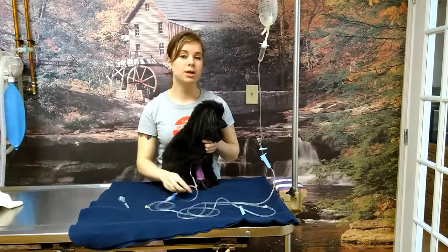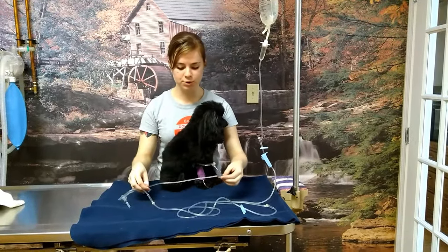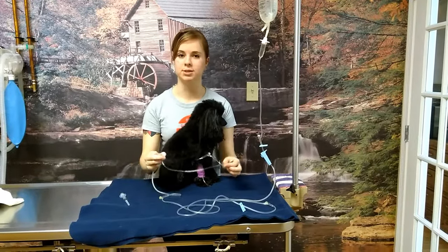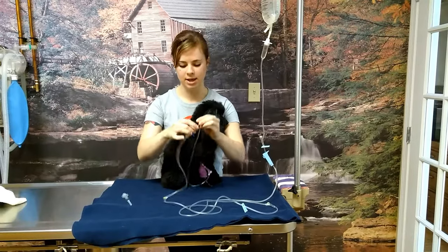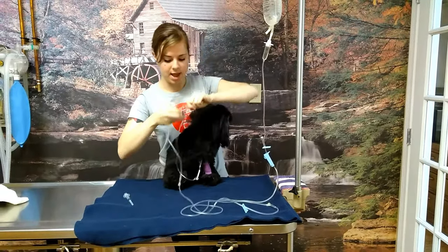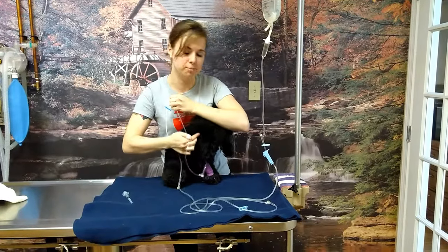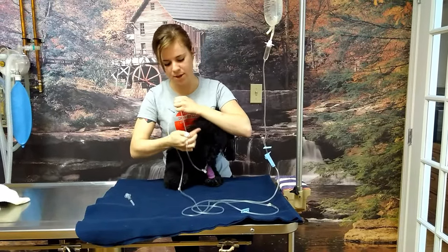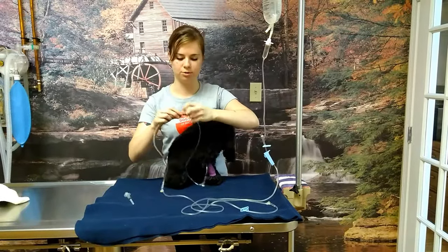It could be a clot on the end of the catheter in your pet's arm. First, we're going to try the pinch pump method to release the clot. You're going to pinch the end of the line near your patient and pump towards the arm — pinch and push, pinch and push — and see if you can push that clot out through the catheter.